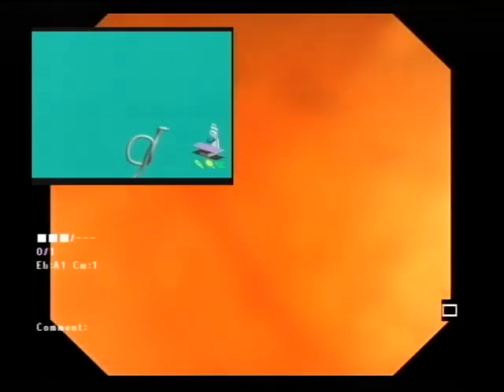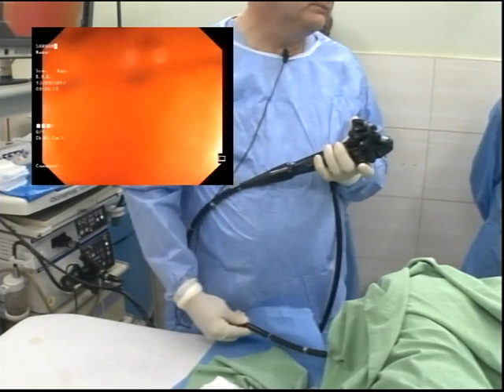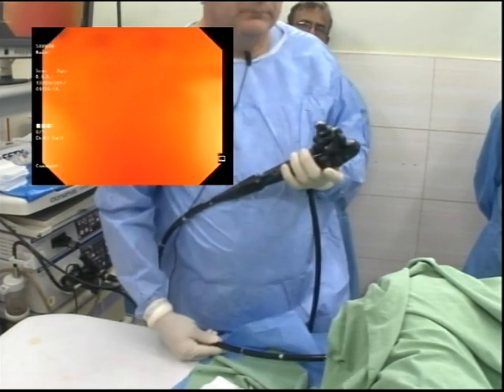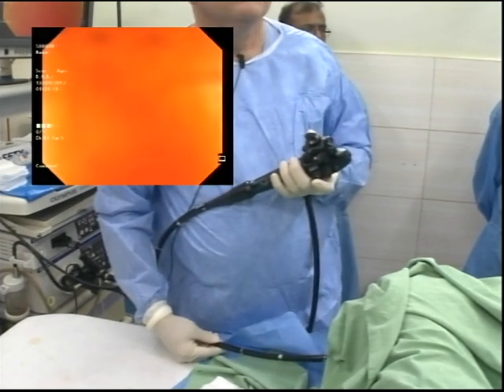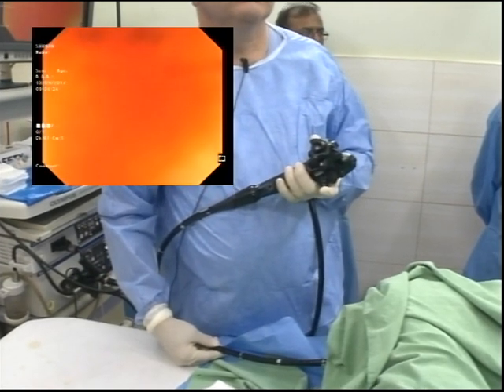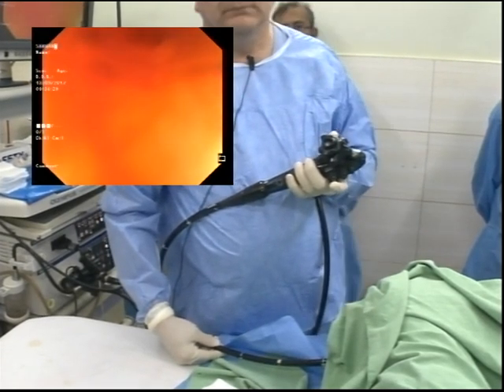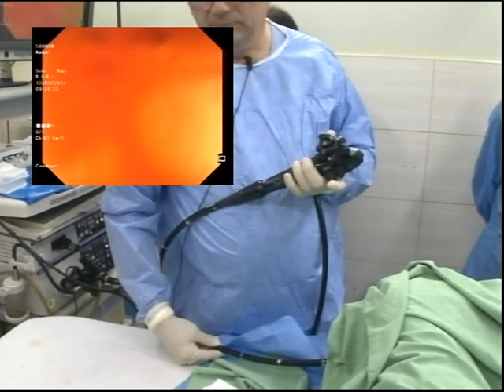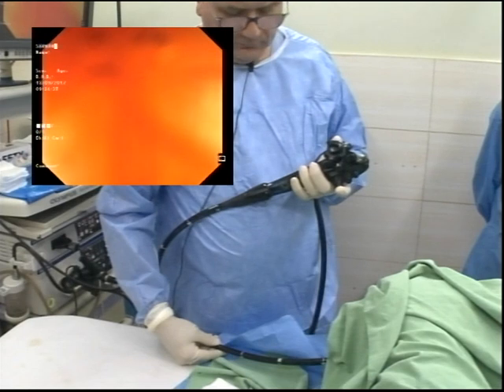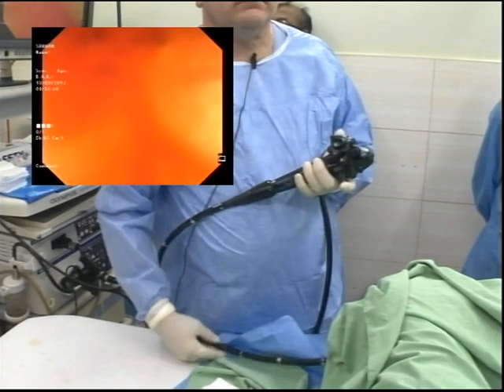Just pause there, Paul, and let me tell them a couple of things you've mentioned. What he's saying is that when the patient starts feeling uncomfortable, the first thing they do is move the toes. The sound and everything else of pain comes very late. So you keep an eye. The moment your patient starts moving their toes or feet, it means they are uncomfortable. It's giving you a message that something is not right there, and you need to tackle that. That's one thing he said.